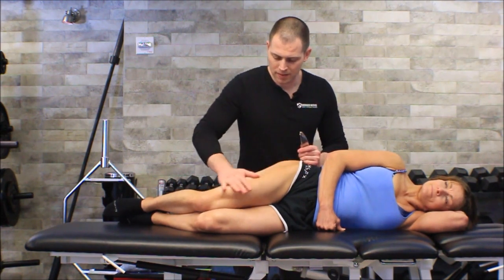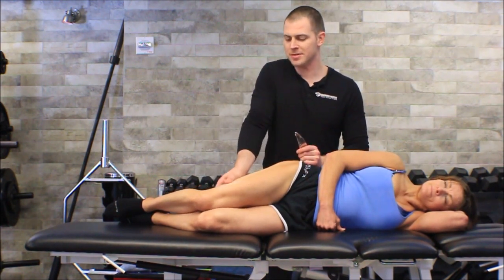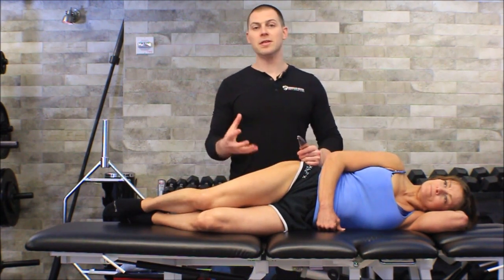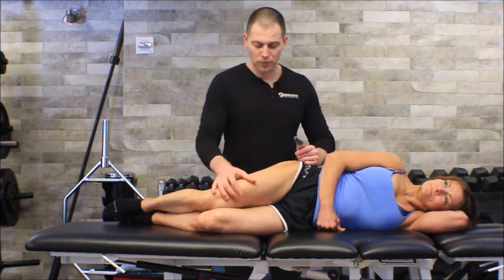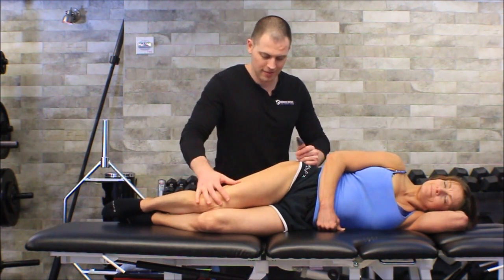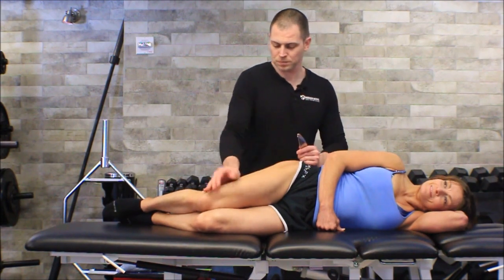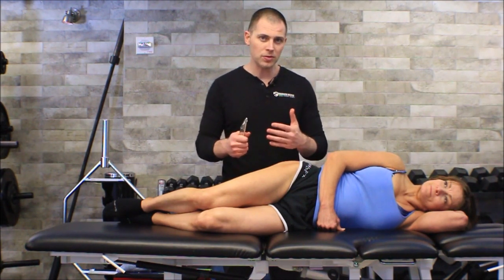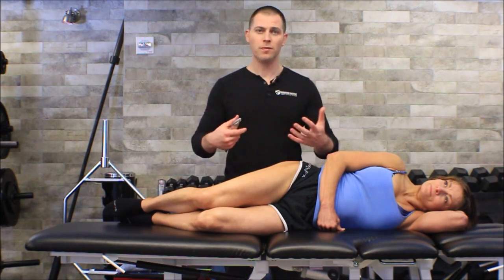As you rub the cream in, if you're a manual therapist this is your first chance to get your hands on the patient — notice if anything feels a little denser, notice if you feel any trigger points or hypertonic fascicles. Then we're going to use our same protocol we've used for other IASTM techniques: start by scanning, then anything that feels non-uniform, go over it to try to break up any binding. Go after trigger points, then do this dynamically to get a little more functional motion happening.